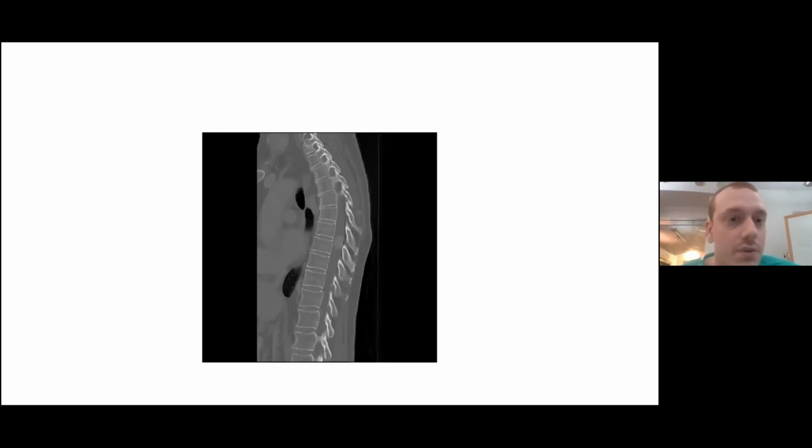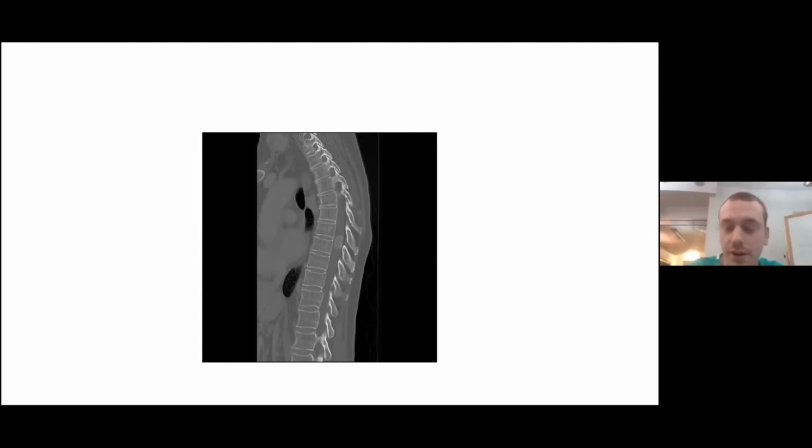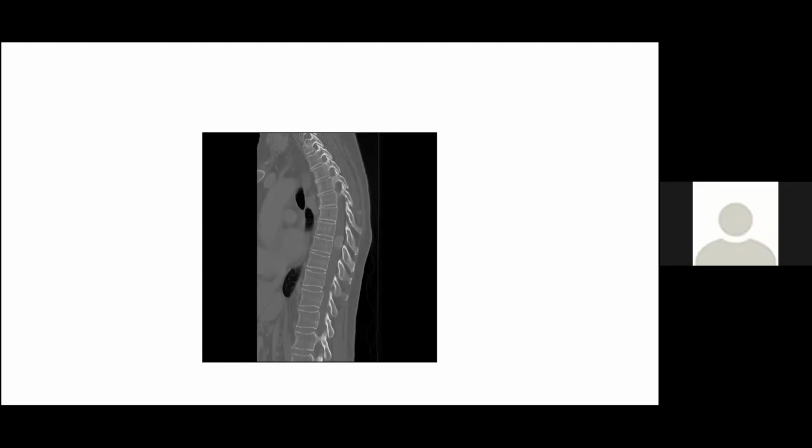Okay. So this is a CT. What do you see? So looks slightly dense on CT. She looks like she has pretty bad osteoporosis as well. Yeah, very good. So it looks like it's calcified. Very good. Okay. So what's your differential? So I think ependymoma, schwannoma, less likely meningioma, and then metastasis we also talked about.